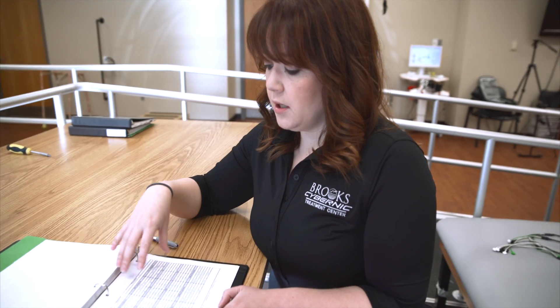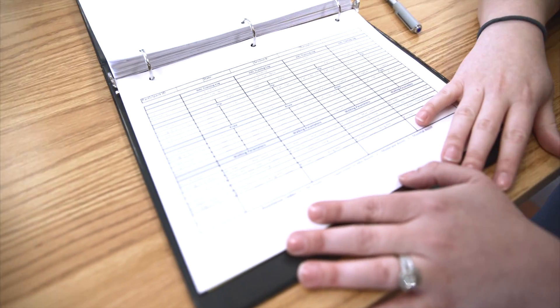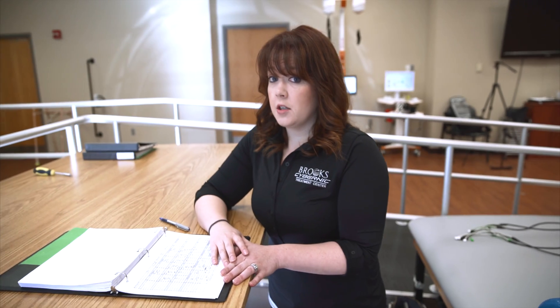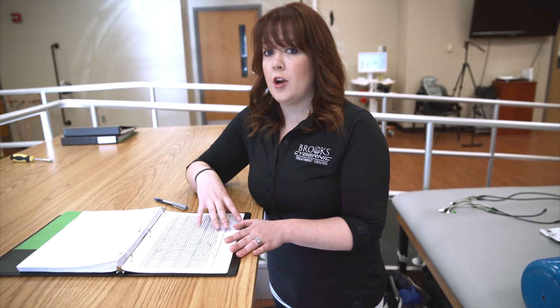This is our daily training log where we write down each walking bout and the different settings that we're using for the patients. There are a lot of different settings as you can see — this is all for one bout. These are some of the settings from previous sessions, so it helps us record what we're doing and what we're working on from day to day with the patient so we can keep track.